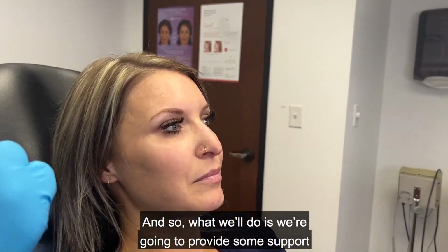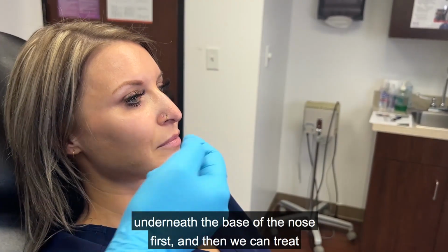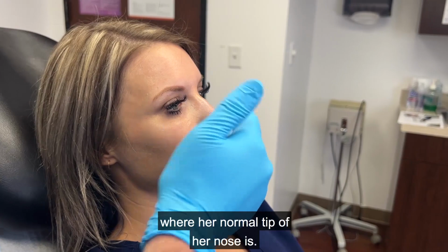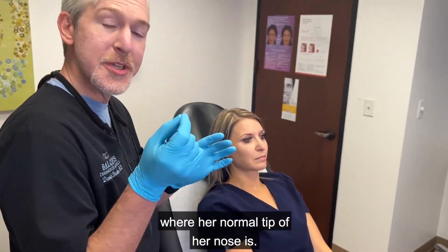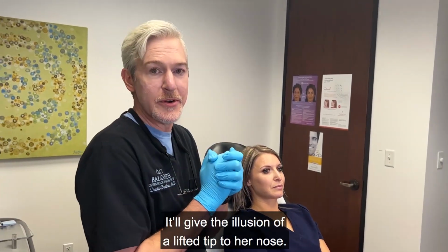And so what we'll do is we're going to provide some support underneath the base of the nose first, and then we can treat up in here and actually create a tip that's kind of above where her normal tip of her nose is. And it'll give the illusion of a lifted tip to her nose.